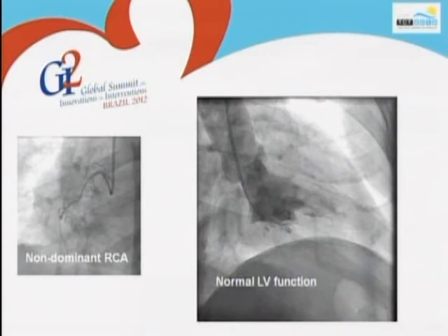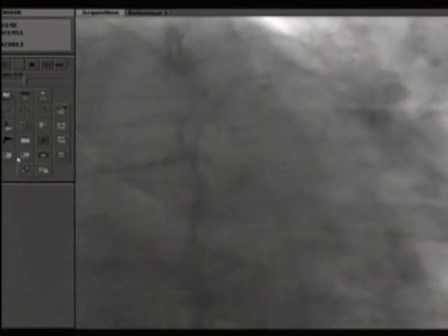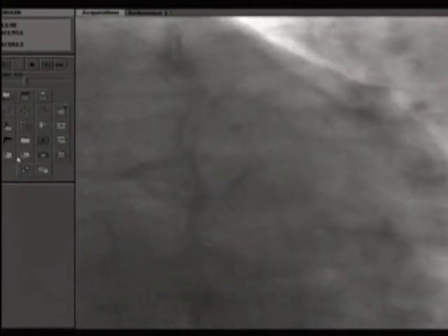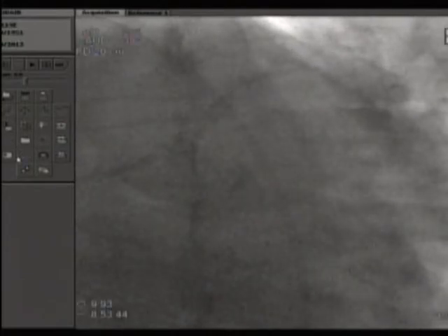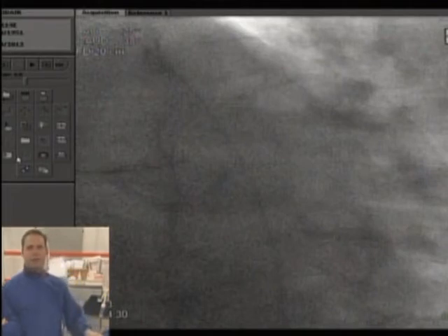So you see here that it's a patient with recurrent angina 12 years after having his stent implanted in the LAD. We got this film done a couple of weeks ago, and 2 lesions to justify the angina. We got the restenosis in the LAD and the tight lesion in the ramus. So we had this discussion, which one of the 2 lesions, if not both, would be responsible for the angina. What does the panel think? Perhaps we could show you the image that we got today.